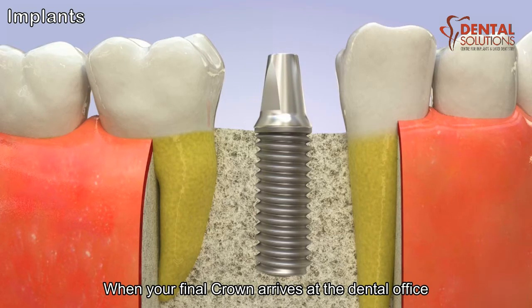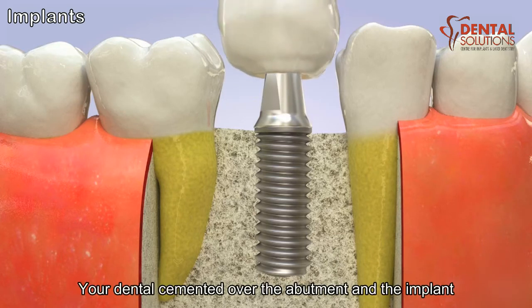When your final crown arrives at the dental office, your dentist will cement it over the abutment and the implant.